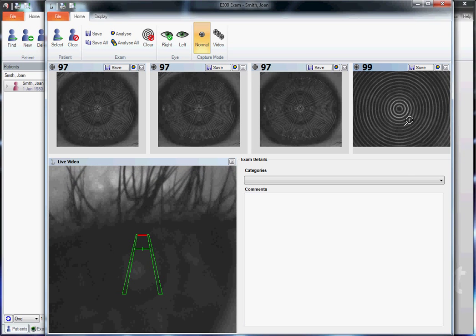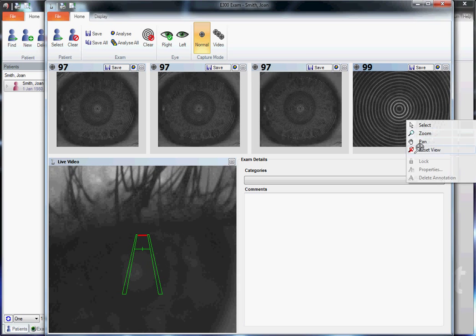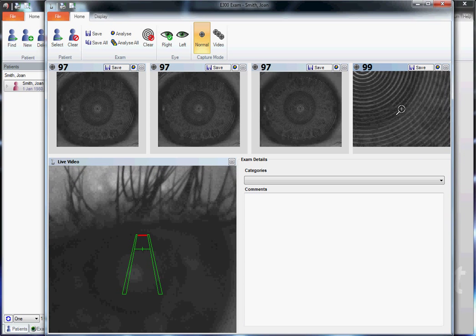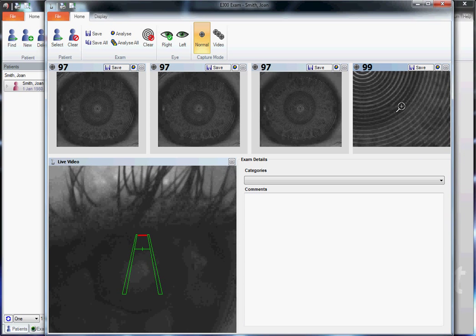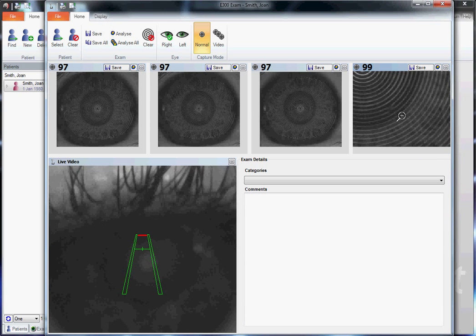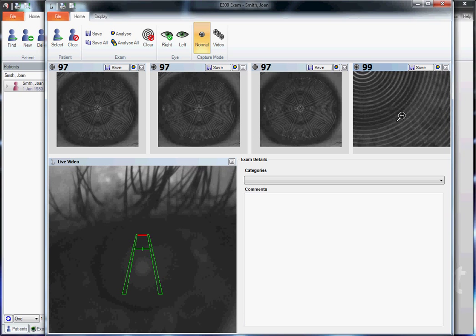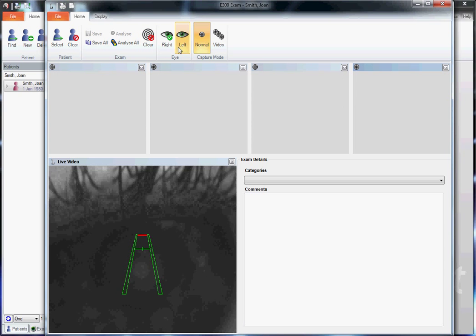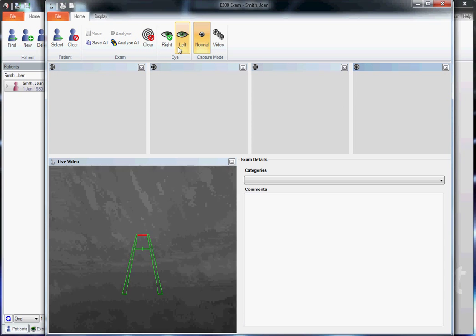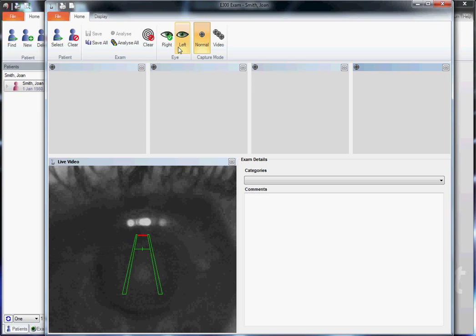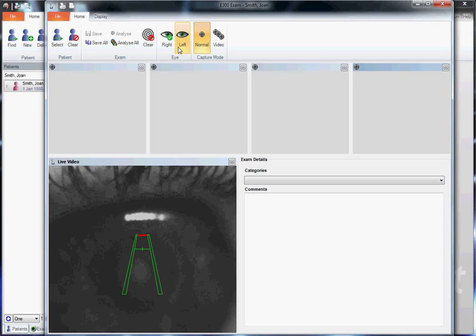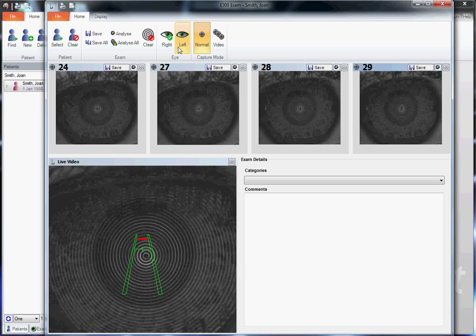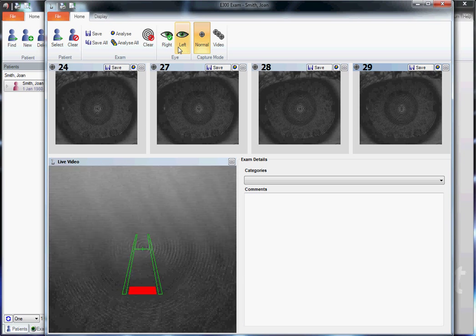A small tear film breakup can be visible right here. That would indicate we should clear images and go back in to take another image with an absence of any tear film breakup or distortion in the placido.